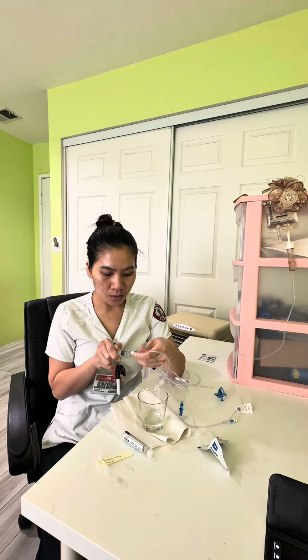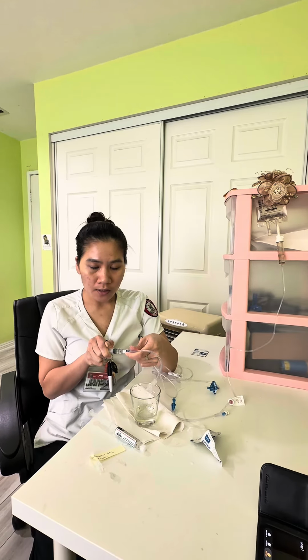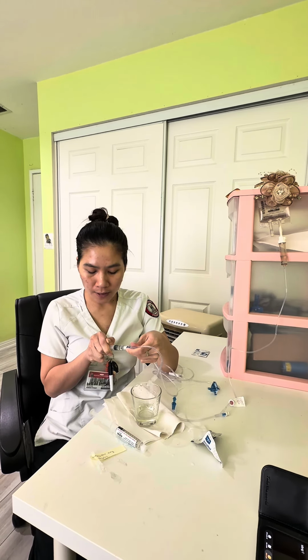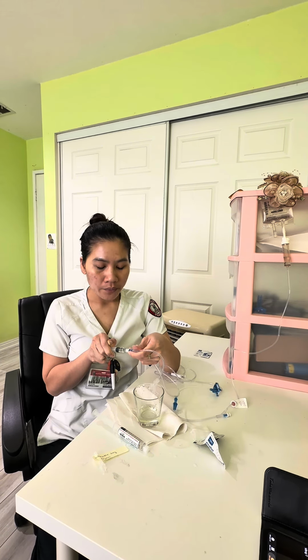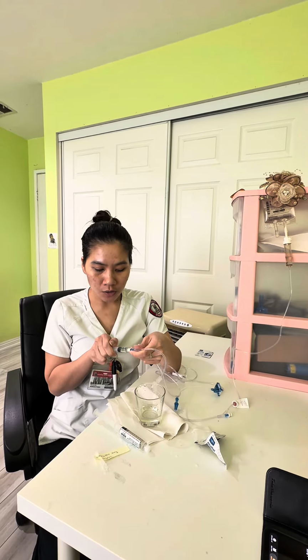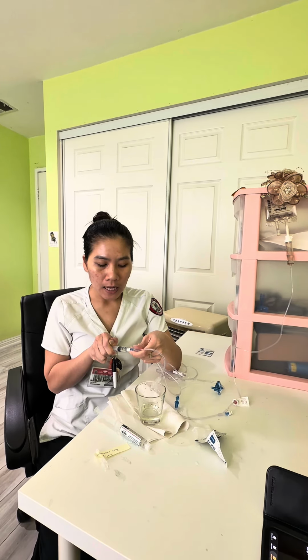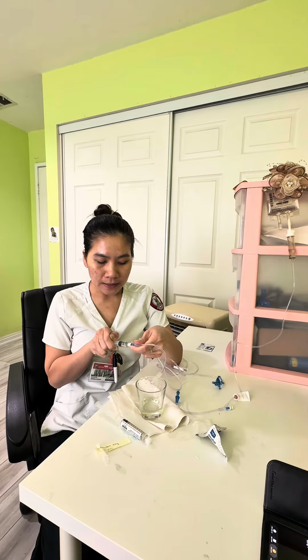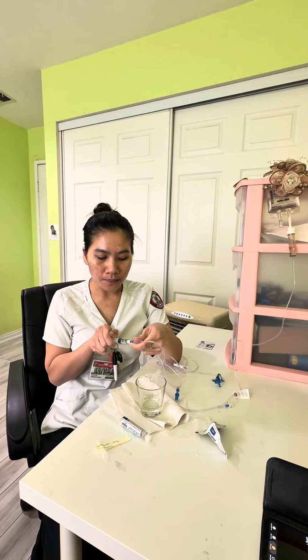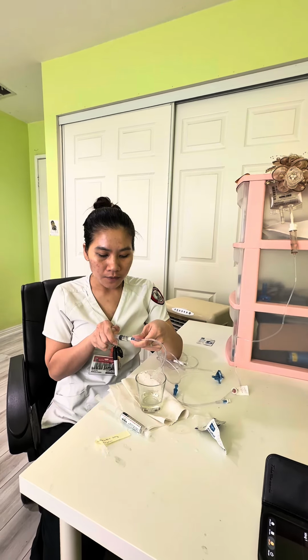While giving the patient medication, I also inform the patient of the side effects and the purpose of the medication, and also how to report any severe side effects the patient experiences after the medication. Before I administer the medication, I assess the IV site to see any sign of redness or swelling, any sign of discomfort or infiltration. During the IV administration, I also assess the IV site for any sign of swelling, discomfort, or infiltration.